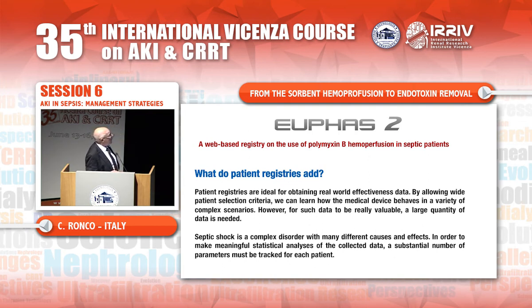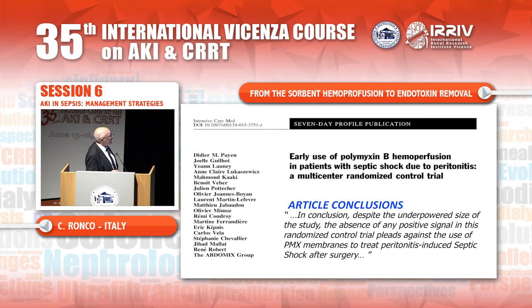And what does this registry add to the knowledge? Well, registries are ideal for obtaining real-world effectiveness data. And I think that because septic shock is a complex disorder and there are many different causes and effects, it's important to collect data on a substantial number of parameters and patients.